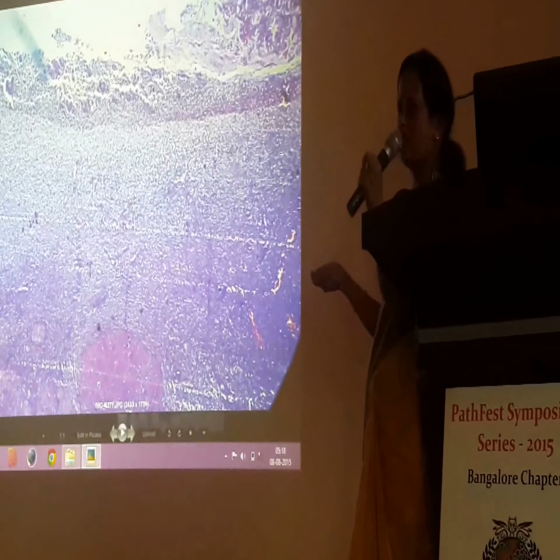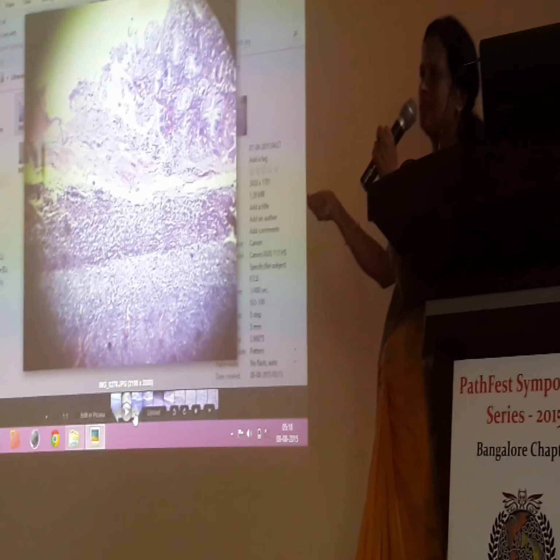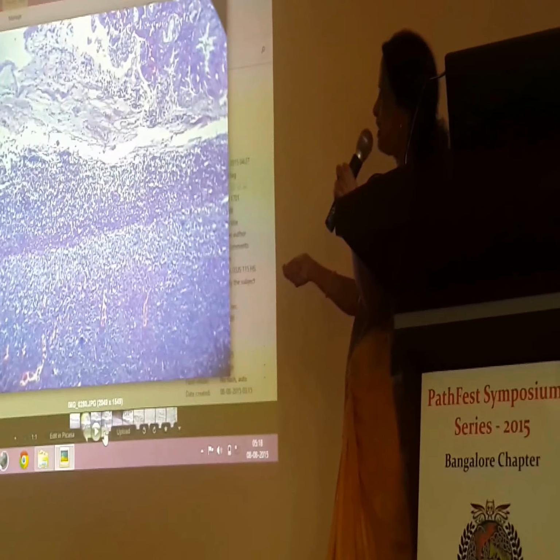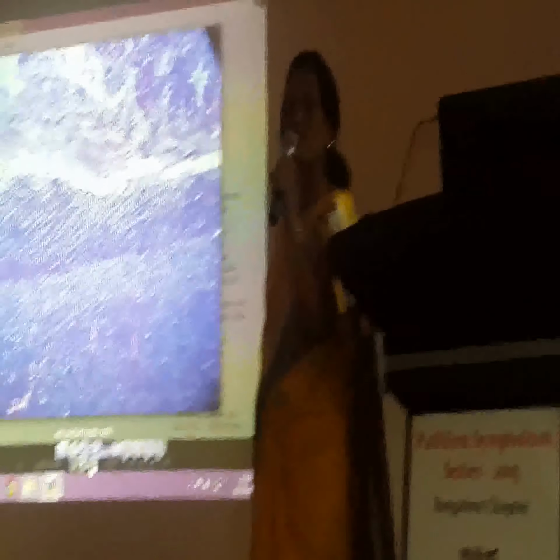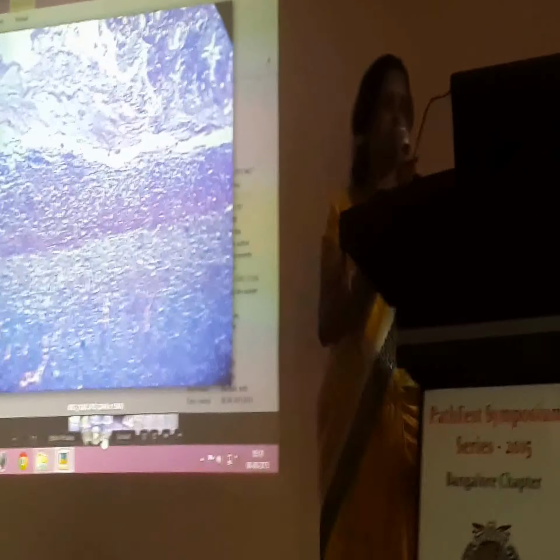It's only necrotic tissue. It's an ulcer. Next. This is stomach. Okay, there's an ulcer. Next. See the zones. So the necrotic zone, this is the exudate, typically with fibrinous material. Then the granulation tissue and cicatrization or fibrosis. So these are typical zones, as described in Anderson when we were reading this. So nowadays, do you see resected specimens of stomach? No, hardly. Only if by chance there is perforation, they operate or remove it. Otherwise, I've seen a lot of nice benign gastric ulcers.